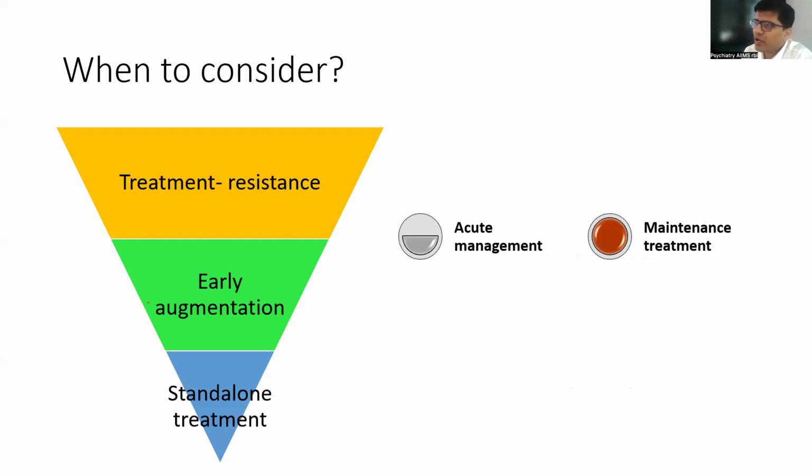So we are talking about how to select the patient. We select the patient on the basis of contraindications; if there is a contraindication, we need to avoid. If there is an indication, then we need to think whether there is a contraindication or not. So it is all about thinking of contraindications and indications.